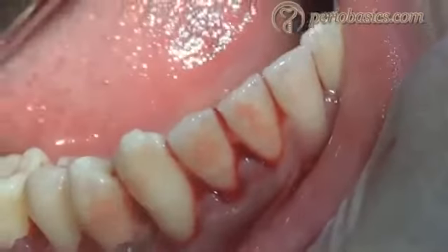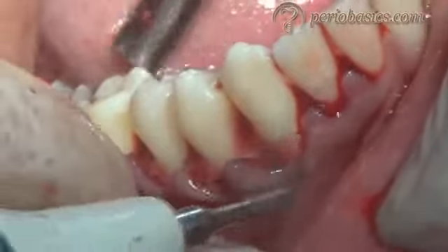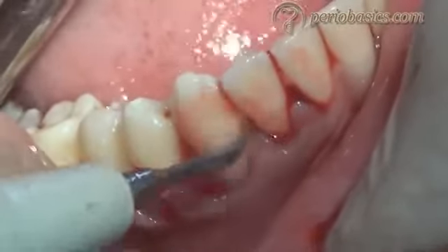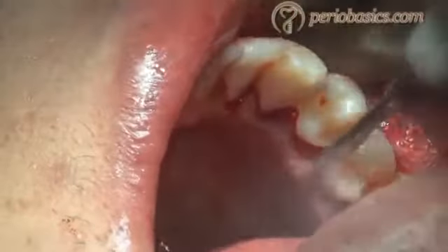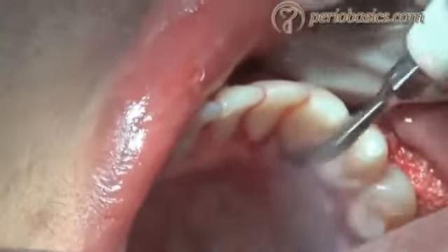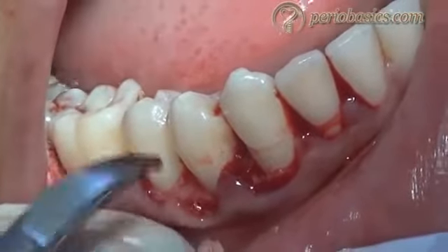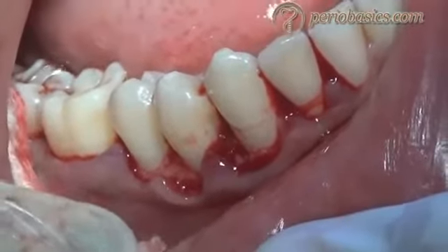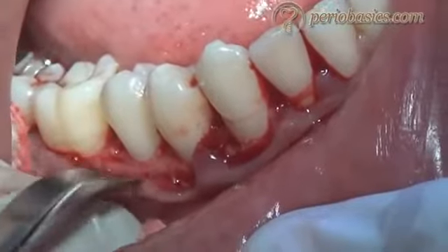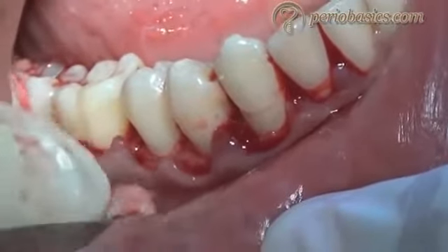As you can see, scaling is done on the buccal aspect, and the same procedure is repeated on the lingual aspect. And the important step in this flap procedure is the removal of the granulation tissue and tissue tags from the flap.